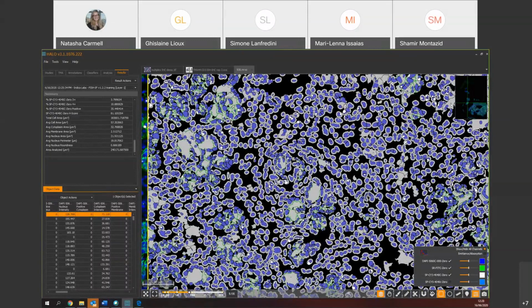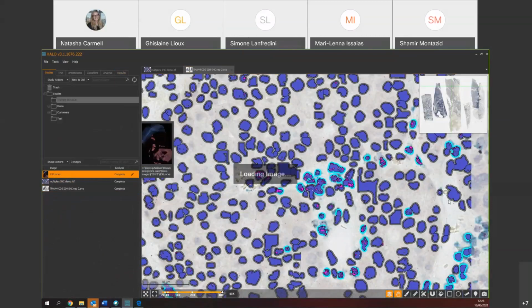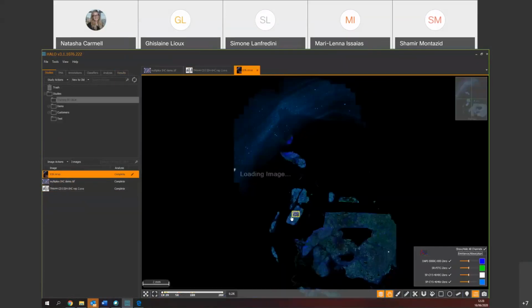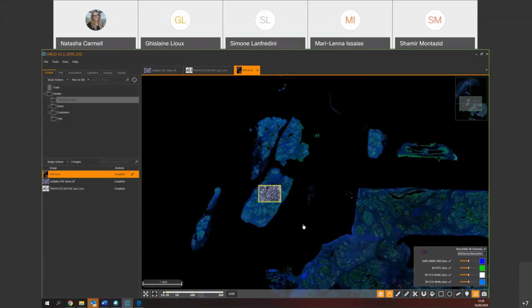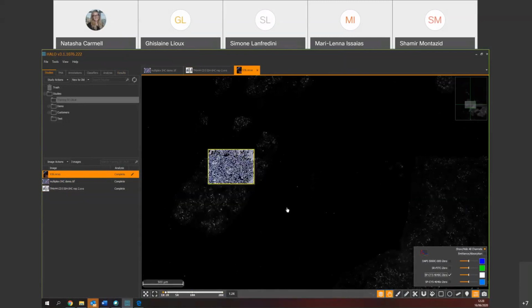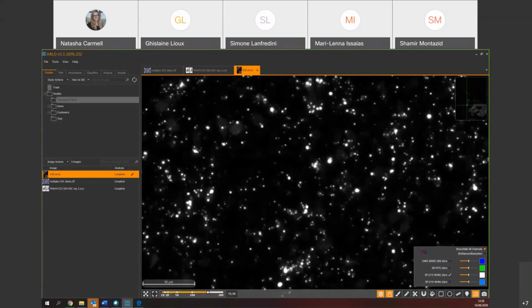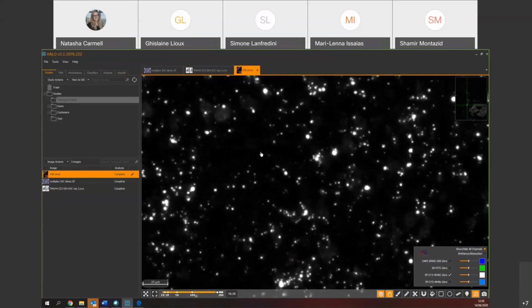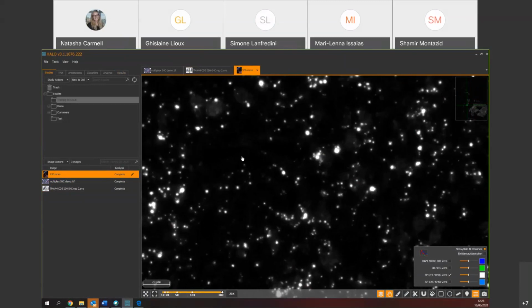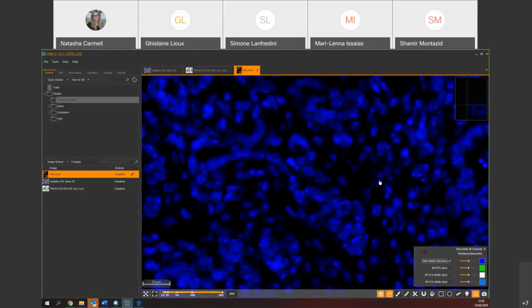The only thing that you might, oh, no, why did I close this? Sorry about this. I can just open it again. Yes, so you will have to, okay, if I probably just go to the DAPI. So actually this I think is, well, it's not a projection because it's not a confocal image, but this is a deep image. So you probably have something quite similar to this if I go back to nuclei.